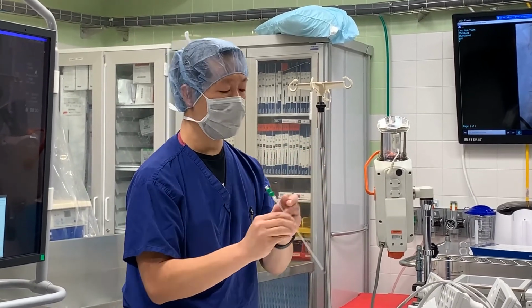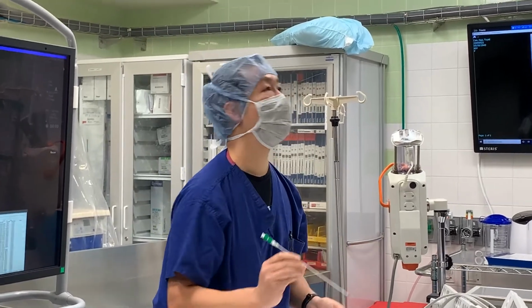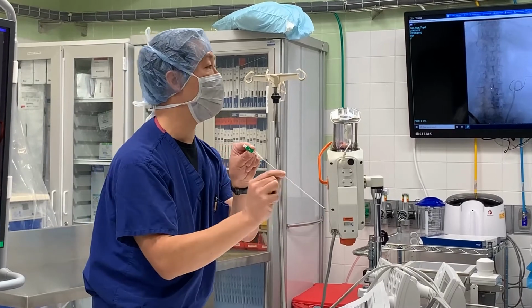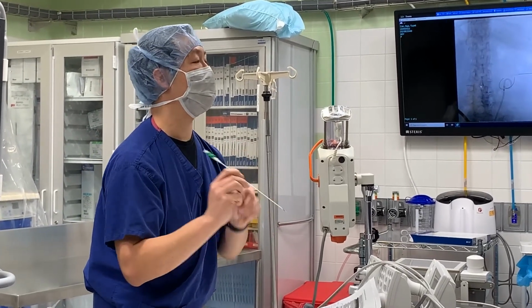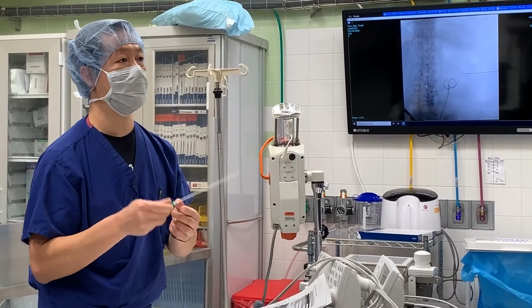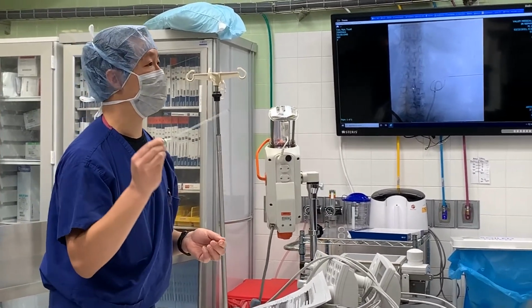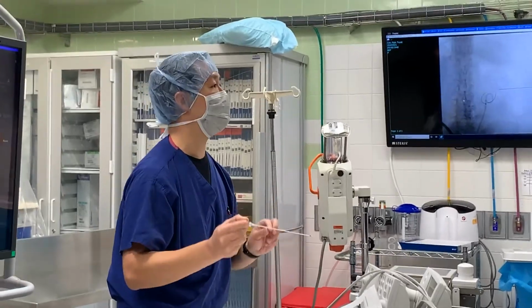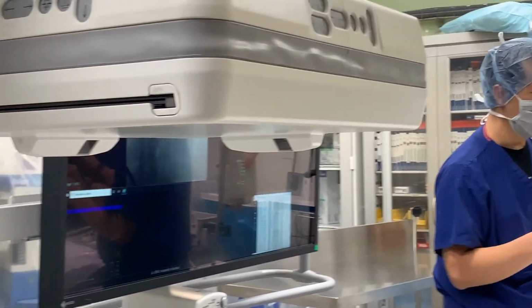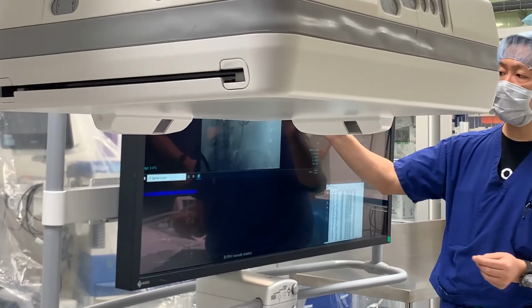Okay? Super, super, super important: when this is put on the wire, it has to be screwed shut. Not uncommon, the front part comes loose. You're trying to push this in, person staring at the screen, pushing. They're not looking down. This is coming off and not sharp. And then we kink the wire and then we lose access. Okay. This has to be screwed together. Don't screw things together too hard, because when this is in and now we can't undo it, that also is a problem, right? So we advance this over this.